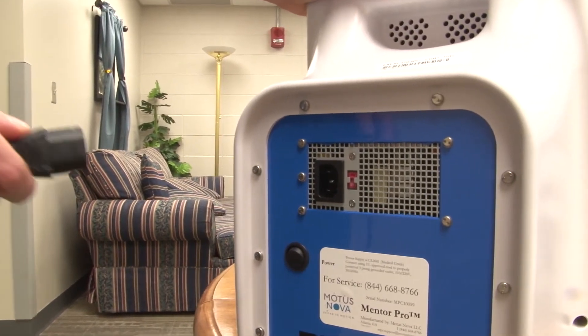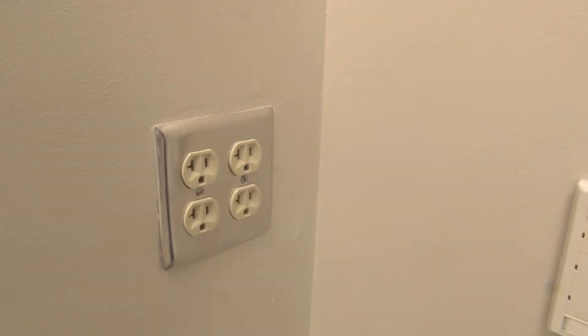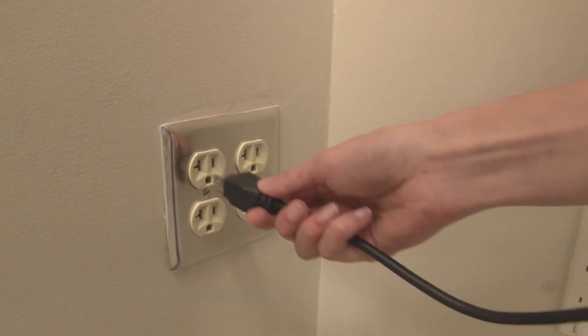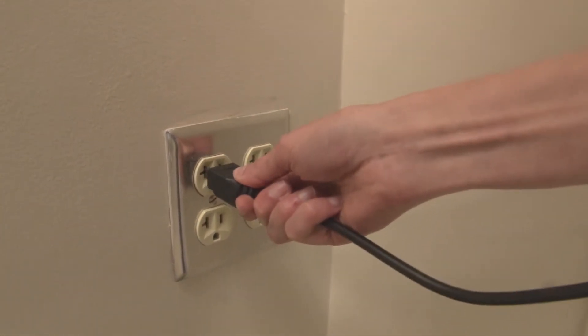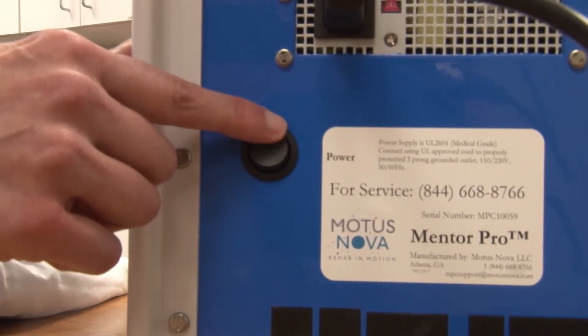When you receive your Hand Mentor, it's important to remember to insert the plug into the back of the control unit. After this, ensure that the power cord is plugged into a three-pronged outlet in the wall. Now go to the back of the control box and locate the power switch and flip it to the on position.